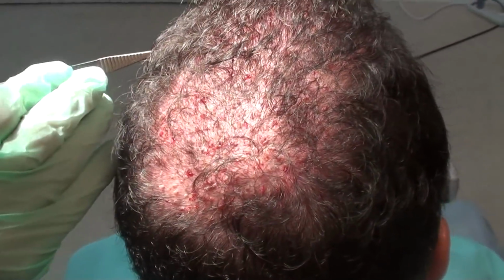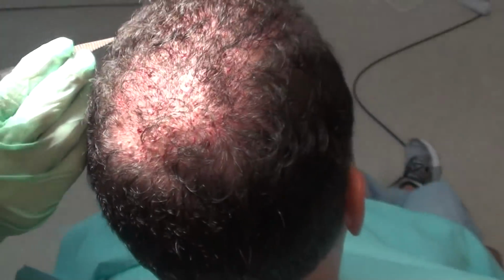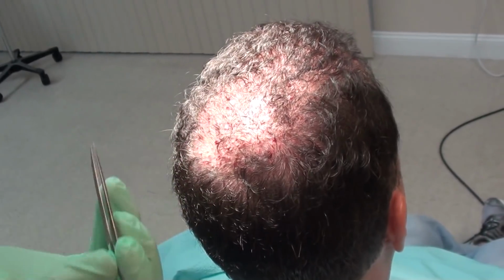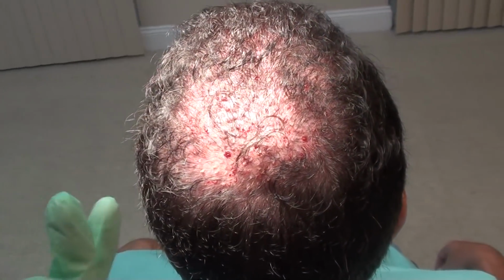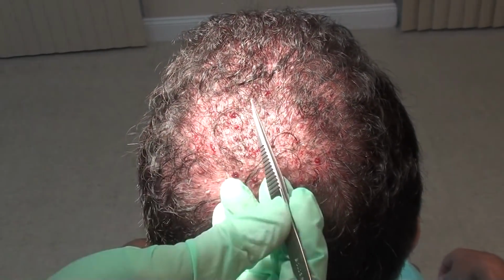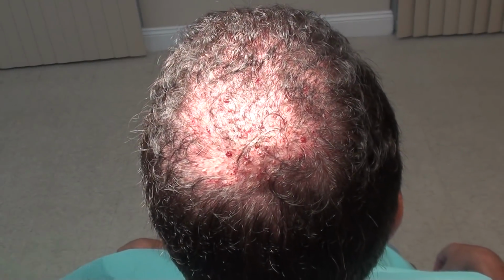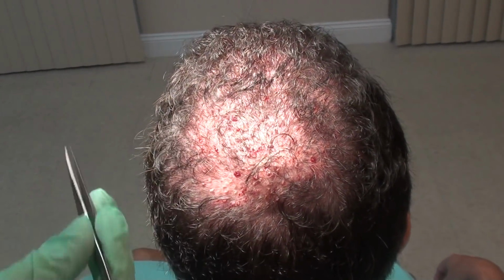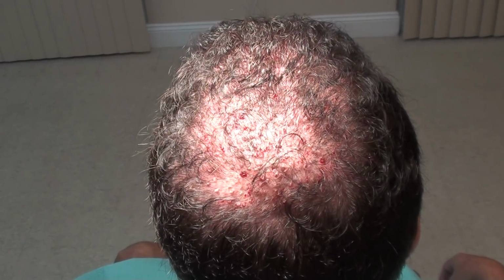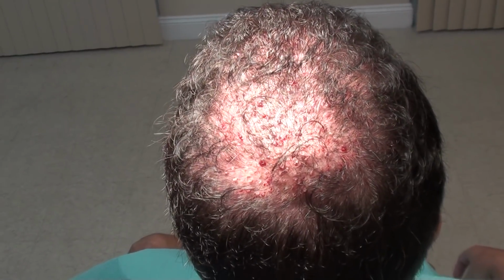We don't want to take these tiny 1 hair grafts that we use in the front for the softness and the naturalness into the crown area, because we want to help achieve more density for the patient. If we only use these tiny little 1 hair grafts in this crown area, we're going to get a very limited result. I can take one of these multiple follicular unit grafts and break it up into 8 of these hairline grafts and spread it out, but that does a disservice to the patient. The patient's going to get much less of a yield, and it's not going to look as full or as natural. So that's why we don't do it that way.